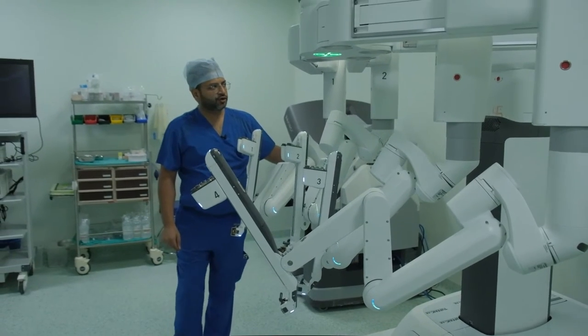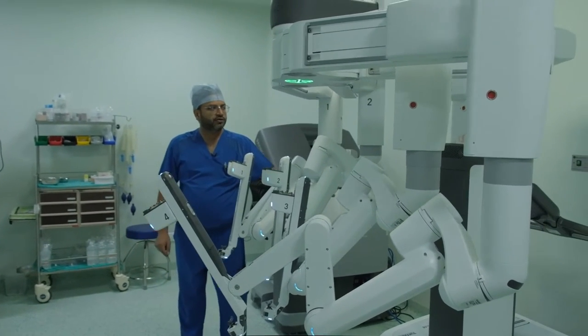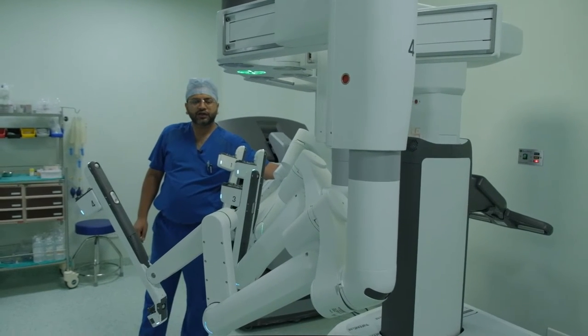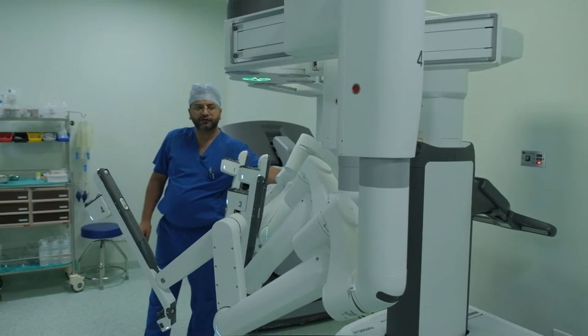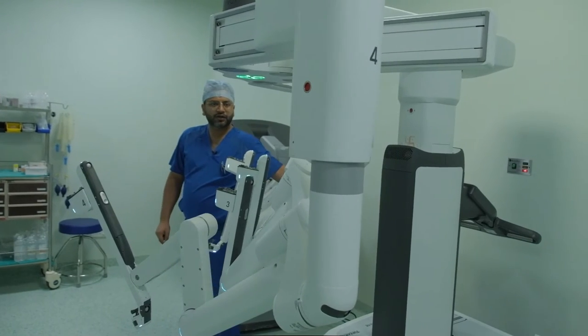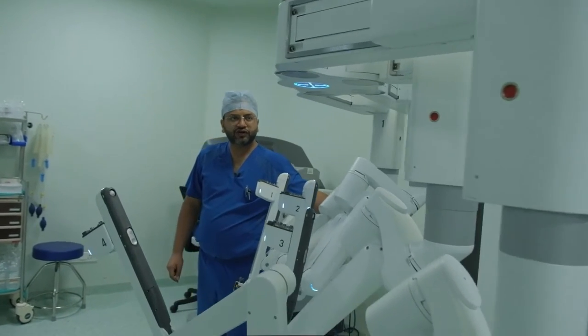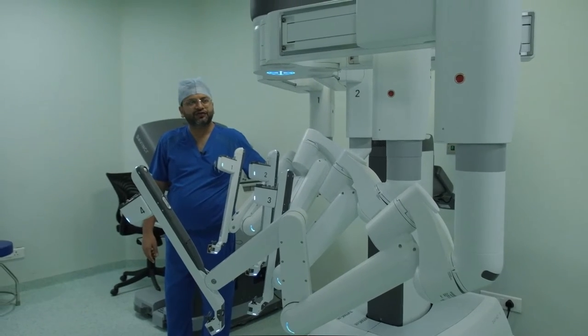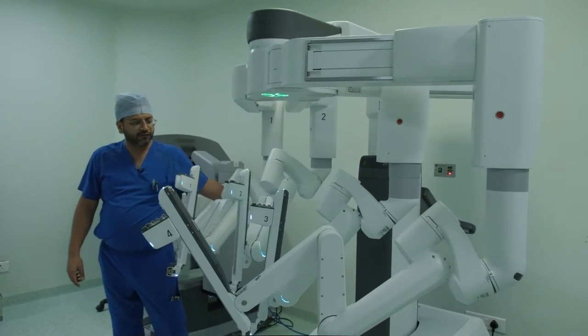And this is the boom rotation. You can see the boom can rotate, so if you want to do a lower abdominal surgery, you can rotate it the other way. And if you want to do an upper abdominal surgery, we can rotate it all the way up and we can dock it without changing the entire cart position. So this is a big advantage with this system.